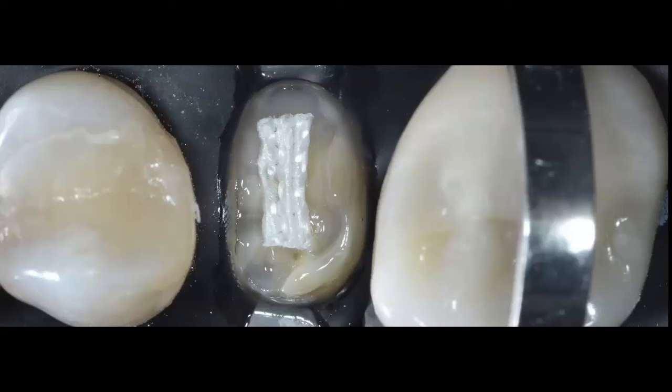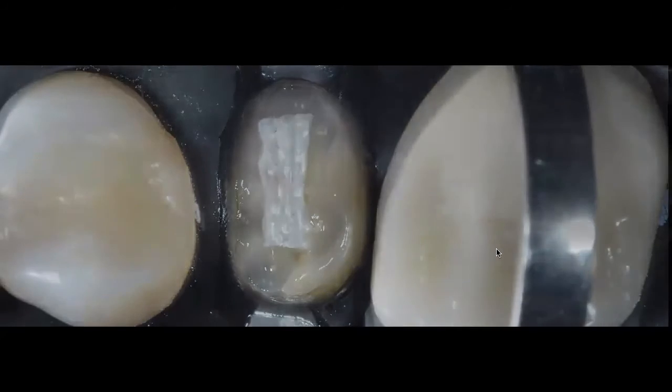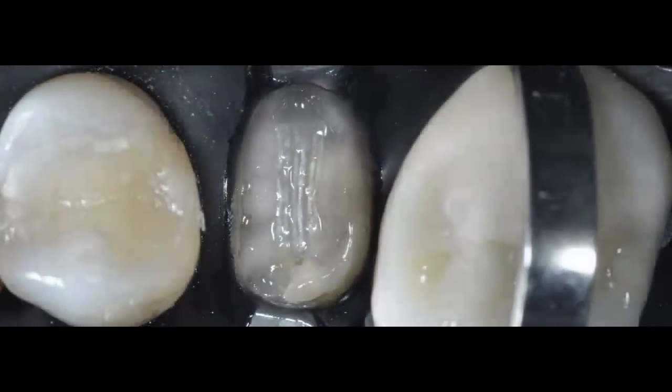And the way that I do this is I place a little bed of flowable composite of a Brilliant Everglow Flow. Then I place a thin layer of the Brilliant Everglow Nano Hybrid Composite, and then I place my fiber on top of both of these layers without curing. Using a micro brush and a little bit of the adhesive of OptiBond Extra Universal, I tap on that fiber. I make sure that I'm pushing it against the composite so that everything is nice and uniform and I don't leave any voids behind. And I'll show you the x-ray at the end of the case.